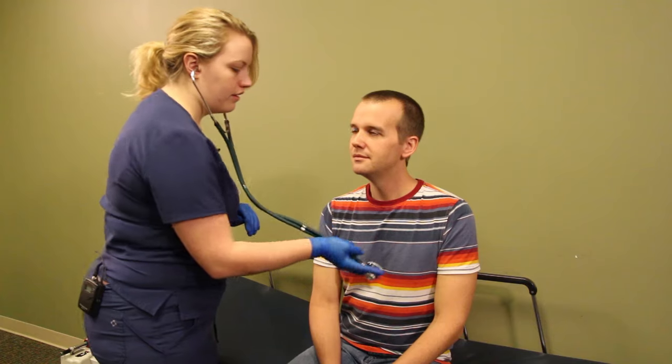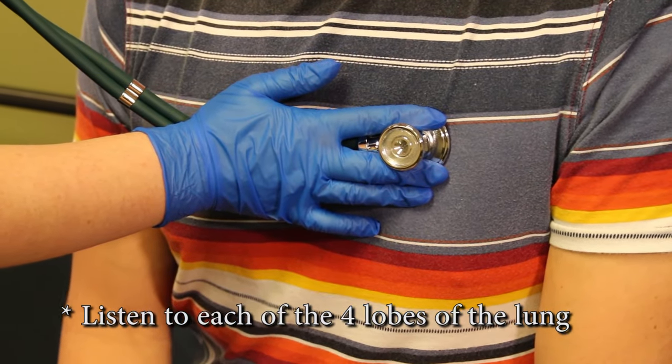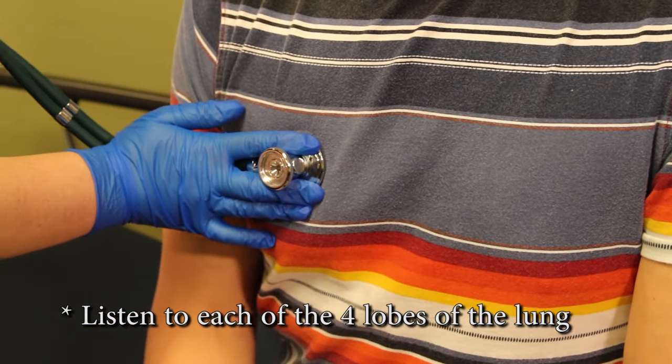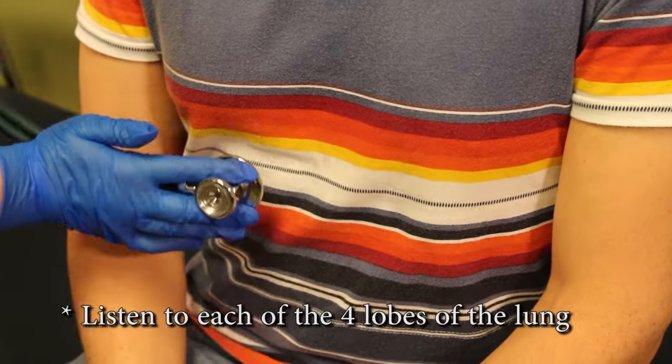We are going to listen in the left upper, right upper, left lower, and right lower.